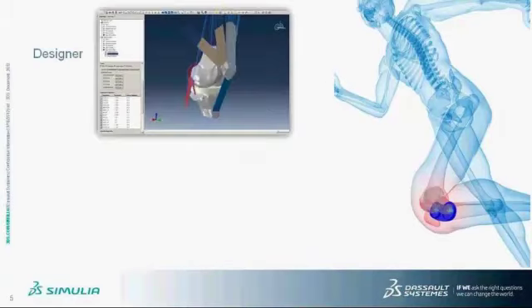The Abaqus Knee Simulator has two interface modes. First is the designer mode. This mode is designed for users who are not familiar with Abaqus and Abaqus CAE. In this mode, only tools that are needed to build the Abaqus Knee Simulator model are collected in the interface.